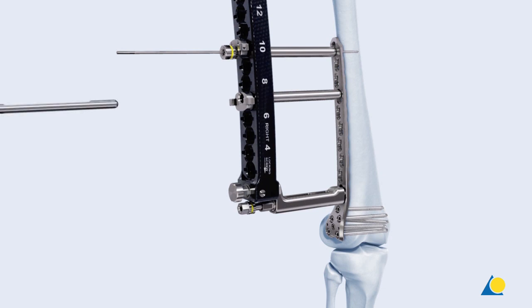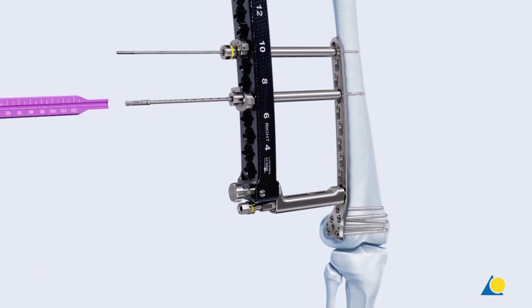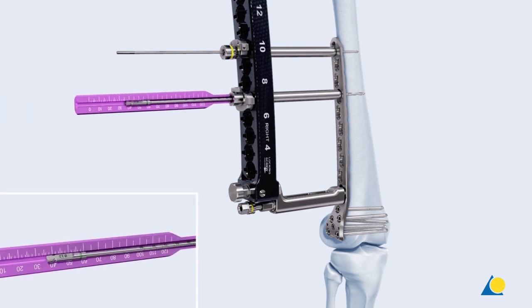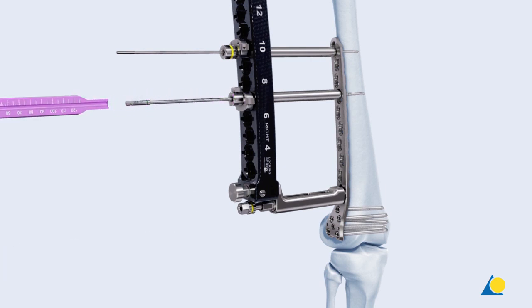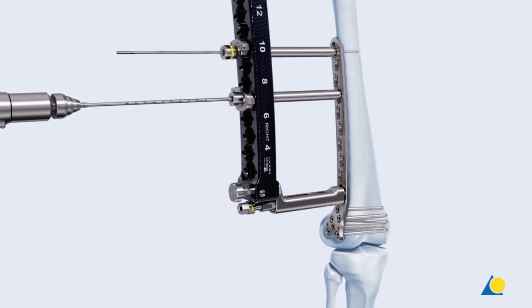Insert the 3.2 mm drill sleeve for neutral position into the guide sleeve, while aligning the self-retaining features until it snaps into place. Use the 3.2 mm drill bit and determine screw length from the drill bit calibration aligned with the top of the drill guide. As an alternative, place the direct measuring device over the drill bit and against the end of the drill sleeve. Determine screw length from the end of the drill bit. Remove the drill bit and drill sleeve.